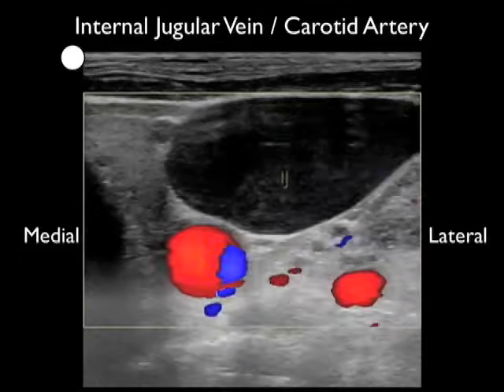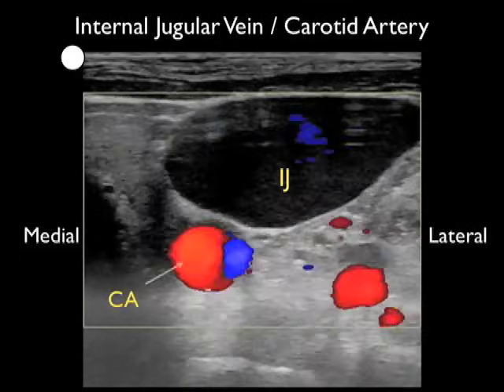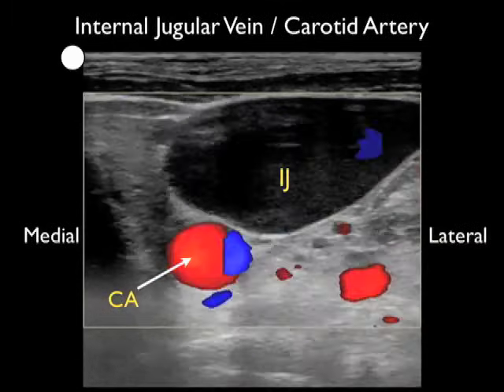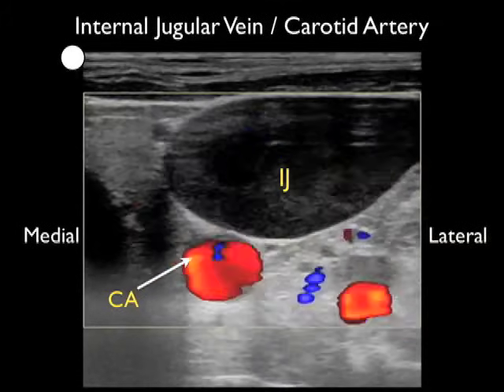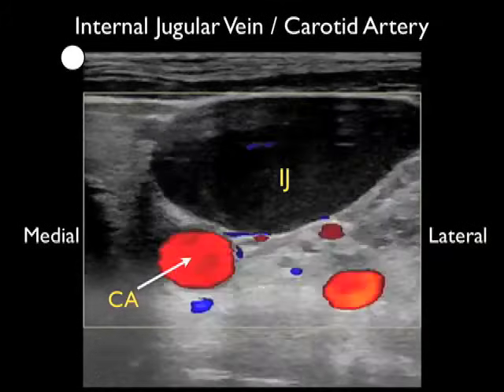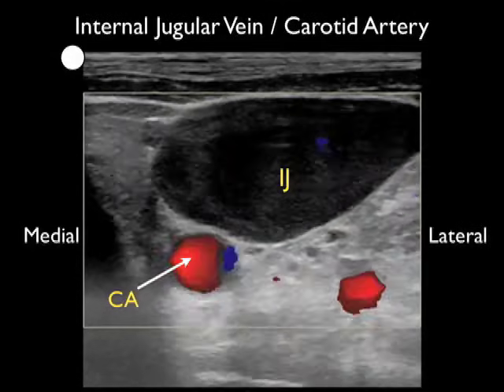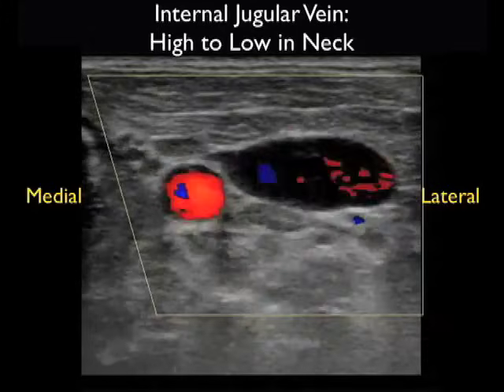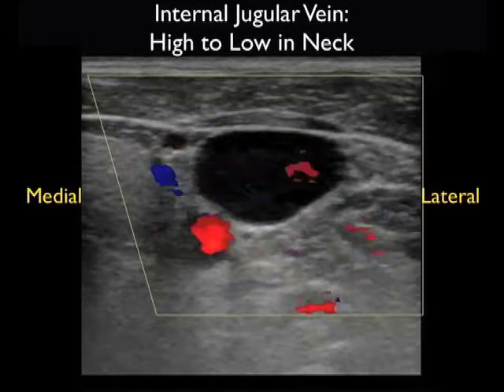Here's another video clip showing the internal jugular vein and carotid artery in a short axis configuration. Notice this internal jugular vein is much more distended than in the last patient. We see that the internal jugular vein is located more superficially at about 0.5 centimeters, and that it overlaps the carotid artery medially, highlighting the great variability in the course of the internal jugular vein in relation to the carotid artery.